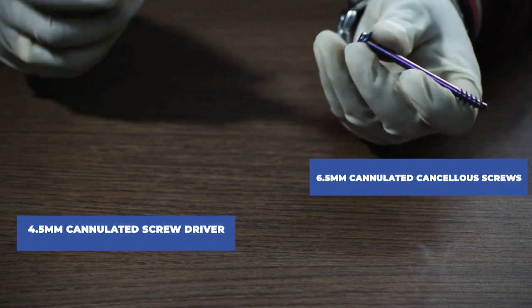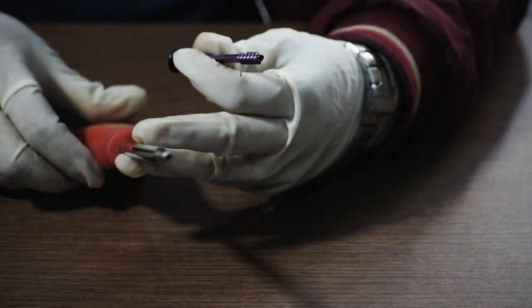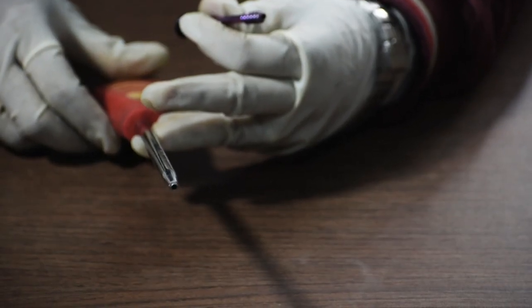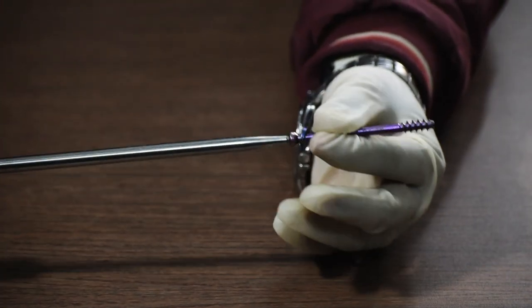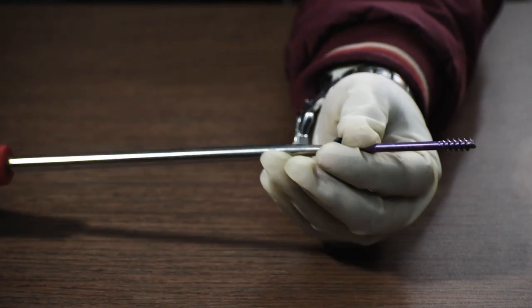And then take a 6.5mm cannulated canceller screw of measured length, with or without washer, depending upon the choice of the surgeon. And then use a 4.5mm cannulated screwdriver to fix this screw through the guide wire. So, that will be all for the process of DHS that is dynamic hip screw fixation with 6.5mm derotation screw system.